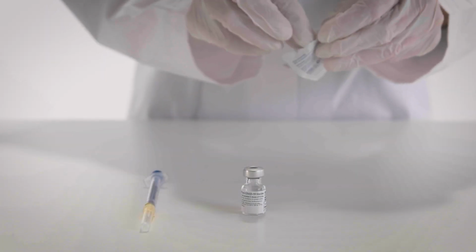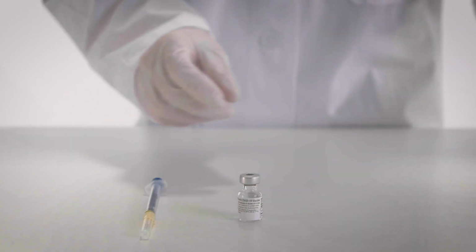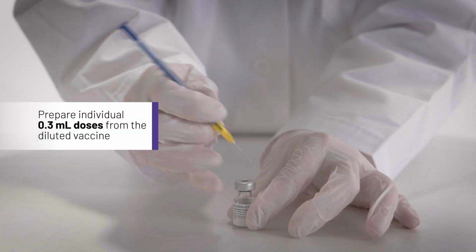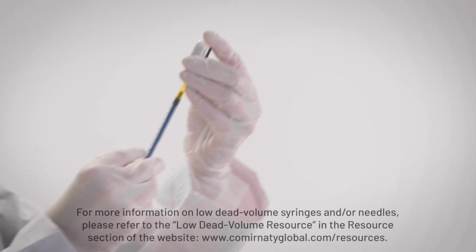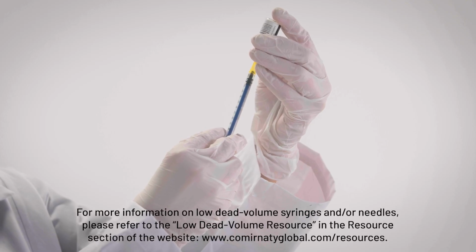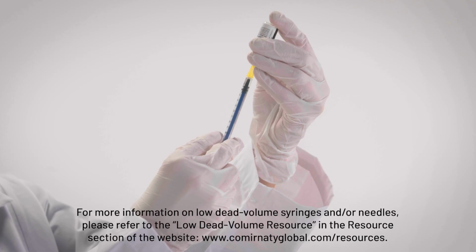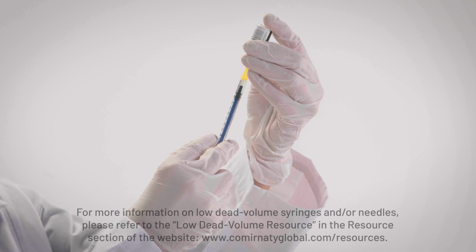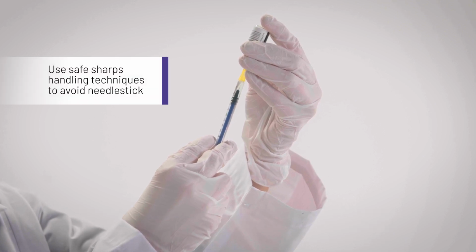To prepare individual doses, start by cleansing the vial stopper with a single-use antiseptic swab using aseptic technique. Draw up 0.3 milliliter of the diluted vaccine into a new sterile syringe appropriate for intramuscular injection. Low dead volume syringes and/or needles with a combined dead volume of no more than 35 microliters are recommended. If standard syringes and needles are used, there may not be sufficient volume to extract a 6th dose from the vial. Use safe sharps handling techniques to avoid needle stick.